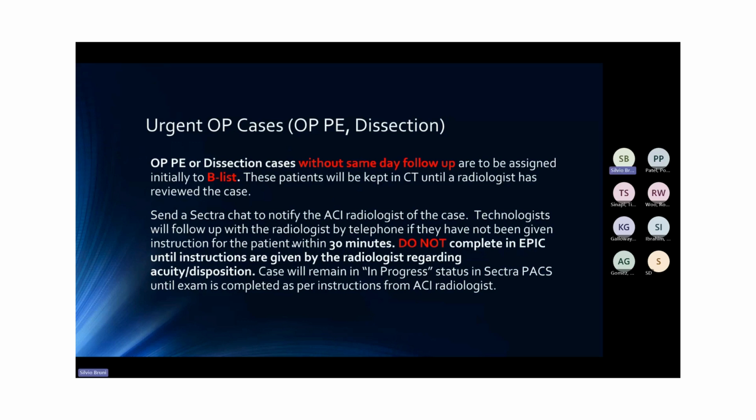The rest of this just describes what we already usually do. Contact the radiologist by Sectra chat to notify them that the case has been done and needs to be checked. If they haven't gotten back to you within a reasonable amount of time, I know the prior documentation says 30 minutes, and I left it as is, but I think it's reasonable to reach out in a shorter period of time by phone.